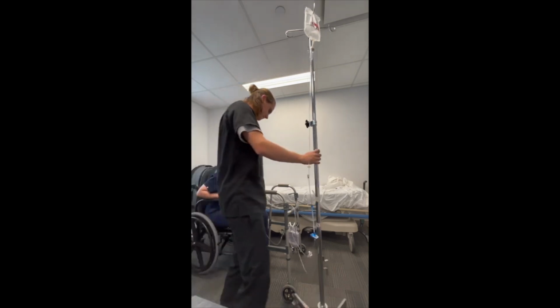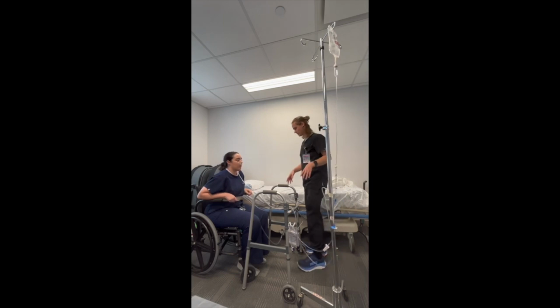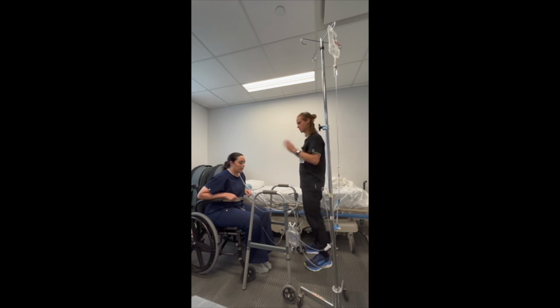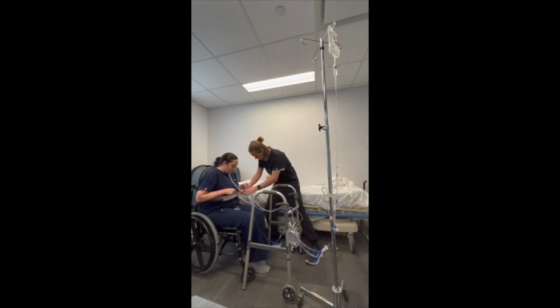Good. Okay, so now let's say this is where we're going to end our session and the patient wants to stay in the chair. We're going to run through our checklist, but this time it's not the pre-mobilization checklist, it's the post-mobilization checklist. We're thinking about what this patient needs to be successful remaining in the chair. So first thing we could do is take this gait belt off.